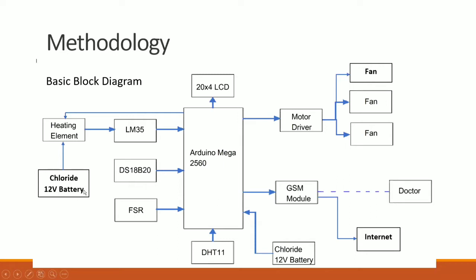So we are using batteries. For example, for demonstration, we can use only one battery. But if you are using it for a long period of time, then we have to use two batteries. There's a GSM module also, through which SMSs will be sent to the doctor periodically after every 5 minutes. As for the motor driver, there is no need for one, but we can use a motor driver if we are using a DC motor.